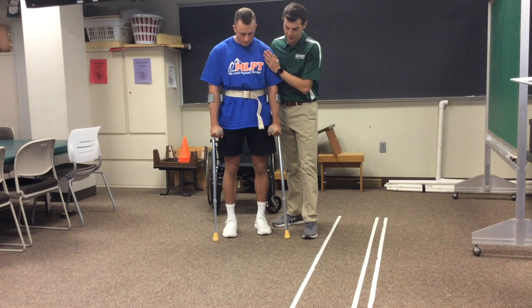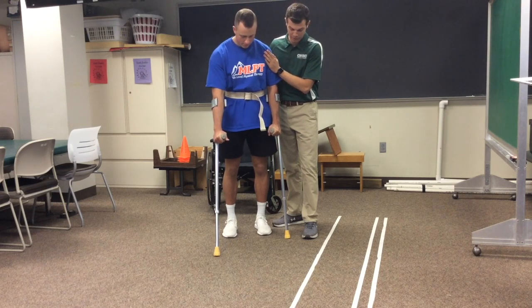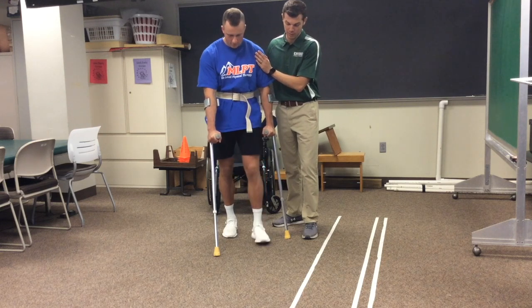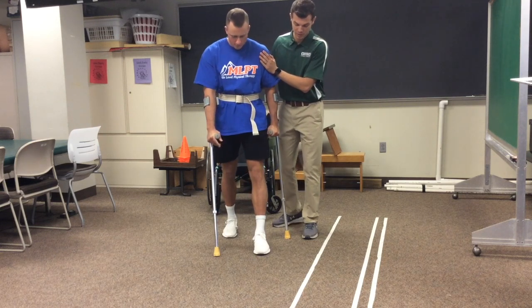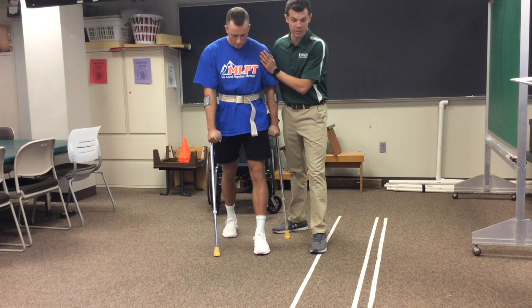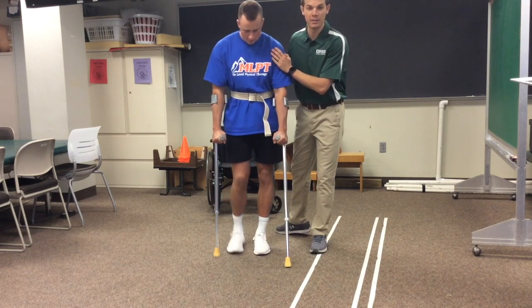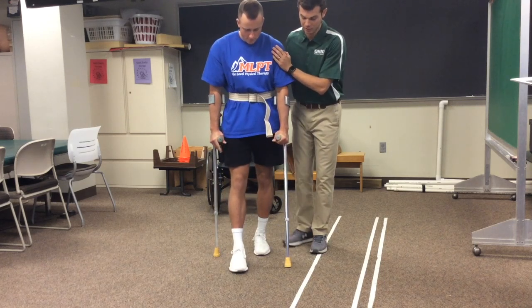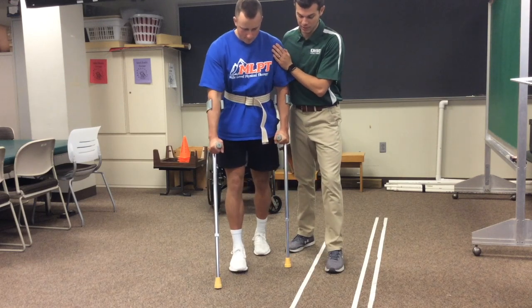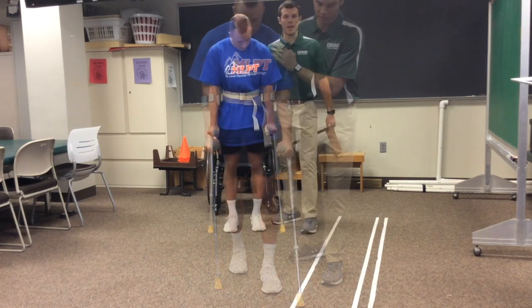Josh, please advance your right crutch. And bring your left foot in line, toes in line with the Lofstrand crutch. And continue with the left crutch advancing, and then the right foot in line with the crutch. Then you're going to continue this sequence. Left foot forward, and then left crutch.